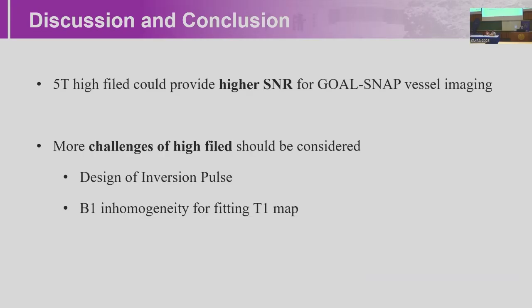In the future, there are more challenges of high field that should be considered. The design of inversion pulses should be considered for higher SAR and field inhomogeneity, and the B1 inhomogeneity should be addressed for accurate fitting of the T1 map.